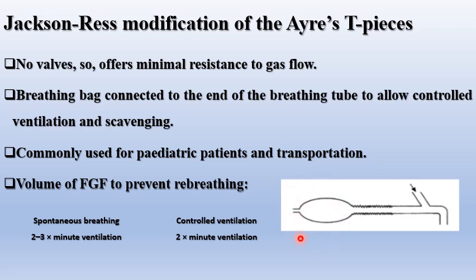This bag here is the way for scavenging of expired gases, and through this opening we can control the opening here, and it acts like a valve to control the pressure inside the system. And I can use it for ventilation manually. It is commonly used for pediatric patients and transportation.